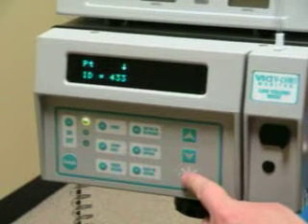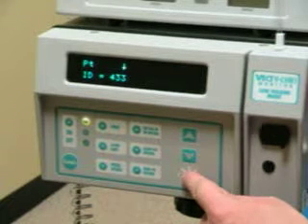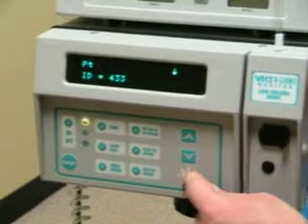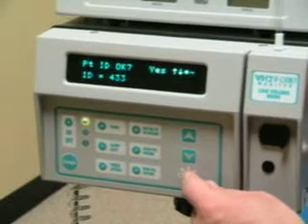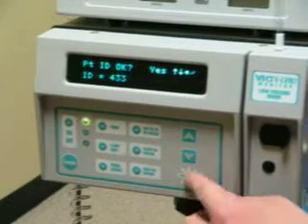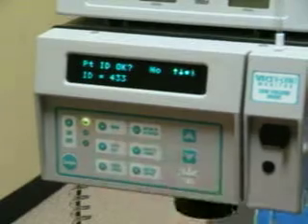And I'm just hitting the star every time I get the number I want to acknowledge it. When I've got all the numbers I need, I'll keep hitting the star key till it gets to the end. It asks if the patient ID is okay, and we're going to choose yes. If we choose no, it'll let you correct a mistake that you might have made.